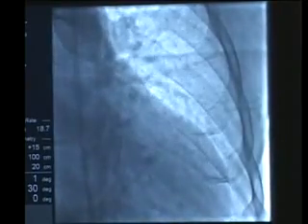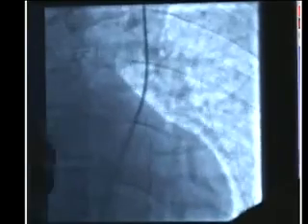We now have a catheter inside the heart, inside the left ventricle. We're going to look at the arteries that supply blood to the heart — the coronary arteries — using catheters that will select the coronary arteries.